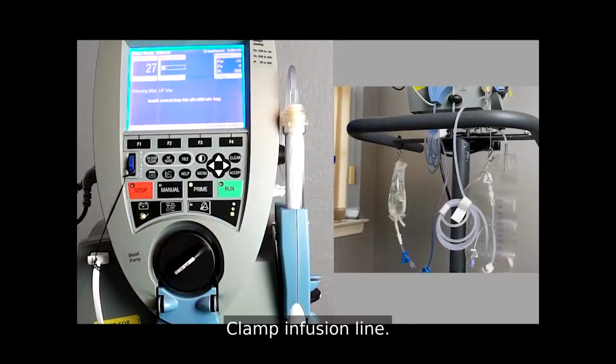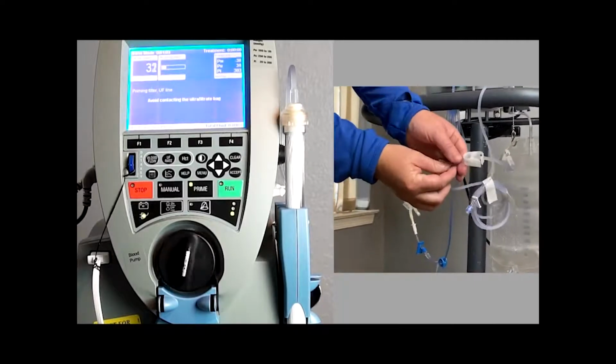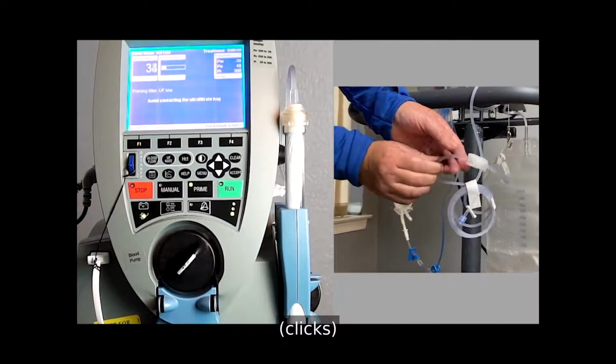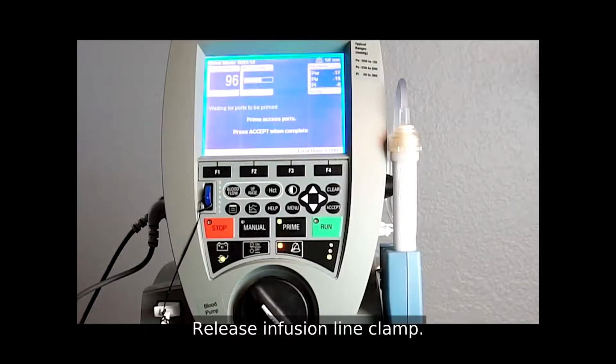Clamp infusion line. Release infusion line clamp.